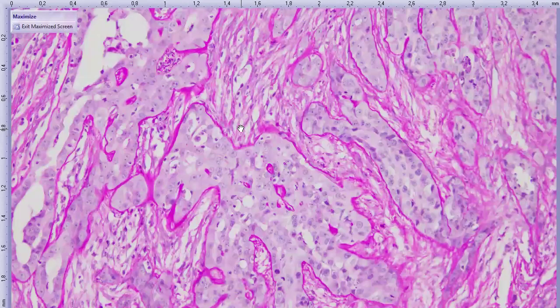I think the response would make melanoma much lower anyway. I agree. And the epithelial arrangement is really obvious, not typical of melanoma. So melanoma is pretty low unless it's a collision tumor, which happens, but I'd be more concerned with a metastatic tumor to the eye causing something like that. It doesn't explain the pigmented portion of it. Again, if you want to argue that there might be two tumors here, I don't think we can go against that. But anyway, took too much time.